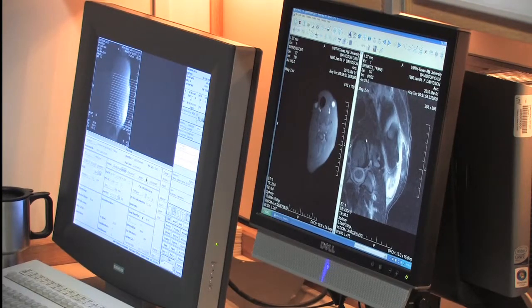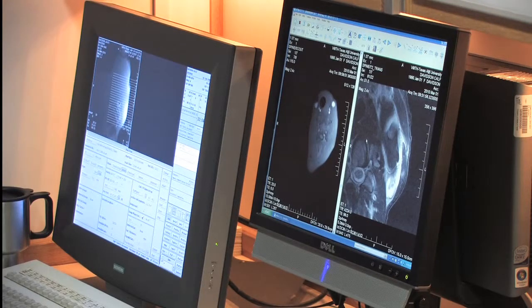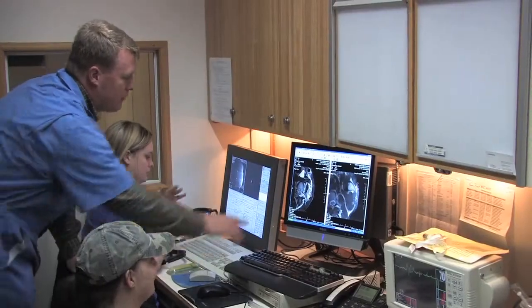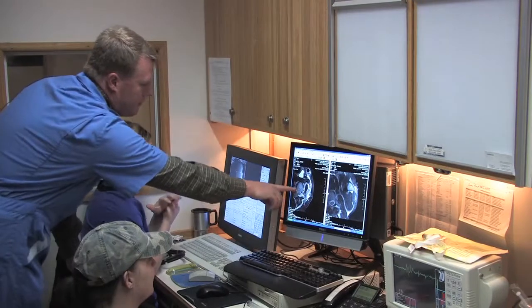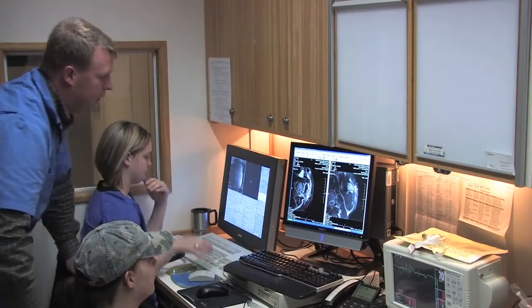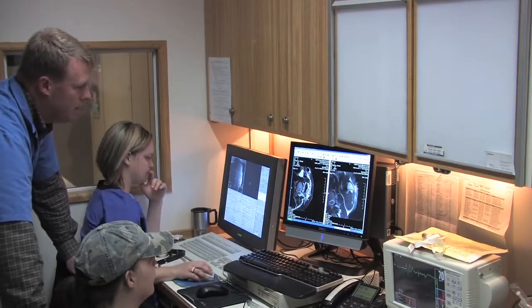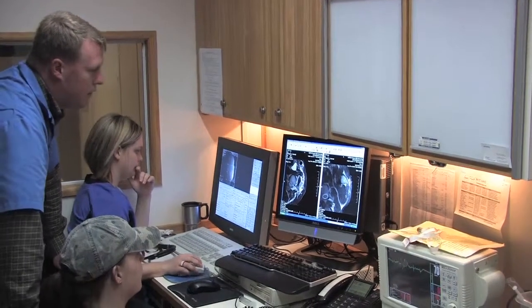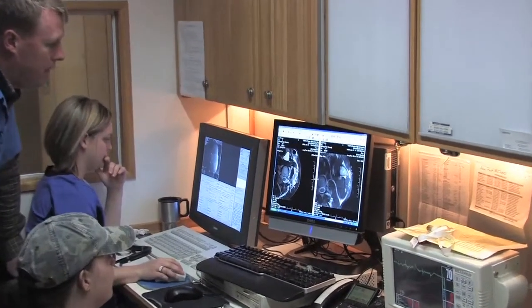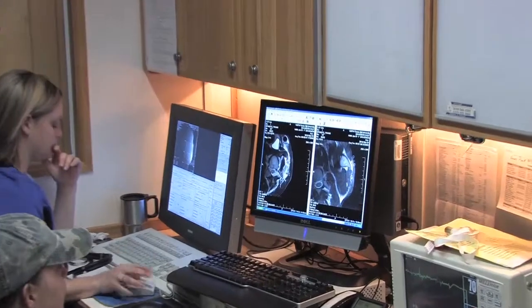Here you can see the lesions in the muscle while the calf is still alive. Here is a good image of the left side of the calf's neck where we injected a clostridial vaccine in the muscle.